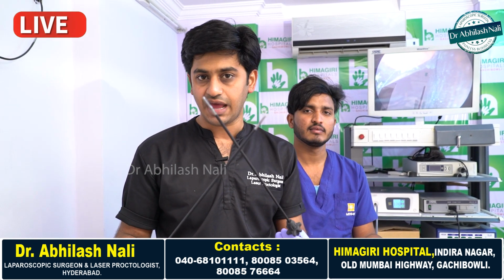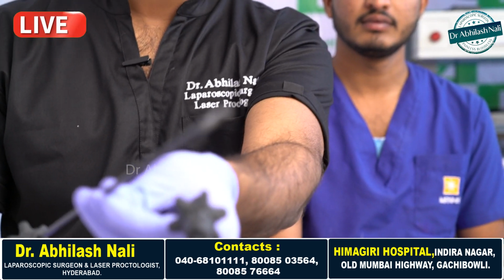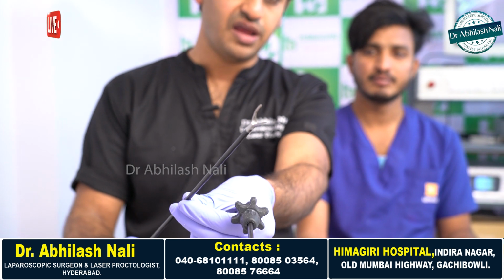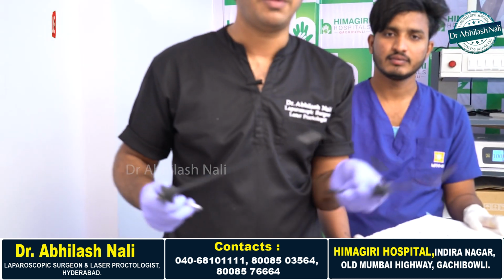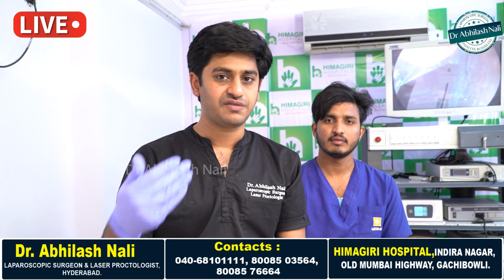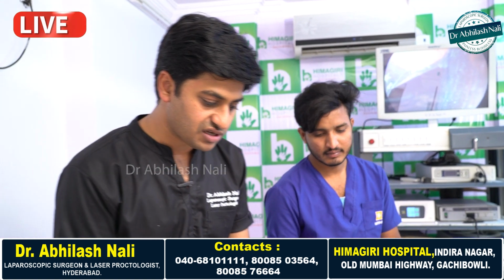How these laparoscopic instruments actually help, we can see. Just like a human hand, with these laparoscopic instruments we are able to open or close, catch, close, and lift it up, and we will be able to remove it. Likewise, we have many laparoscopic instruments even for suturing, cutting, etc., to control the blood loss.